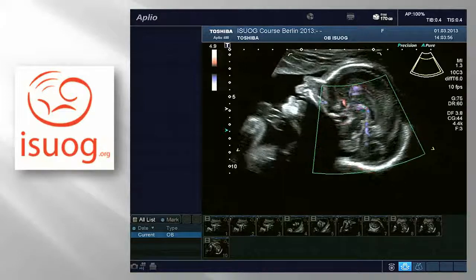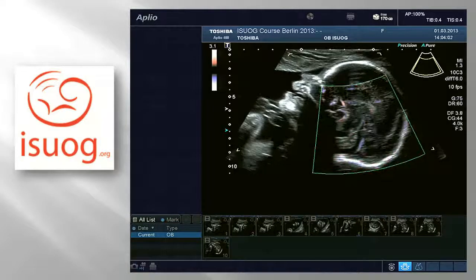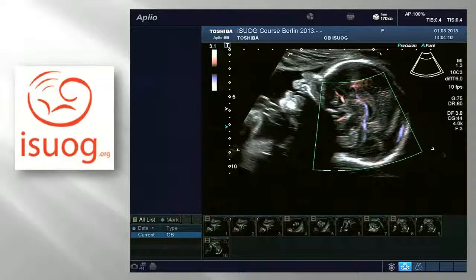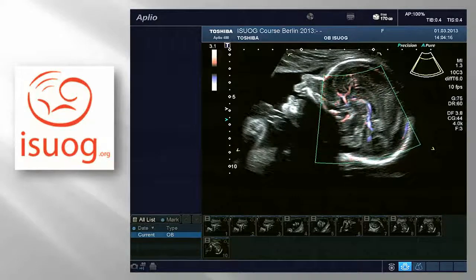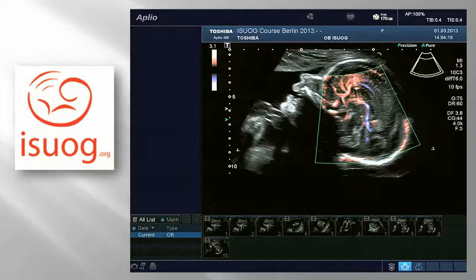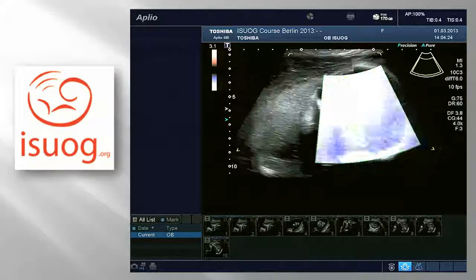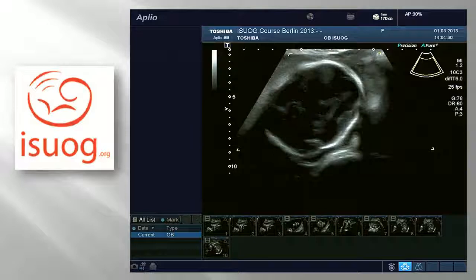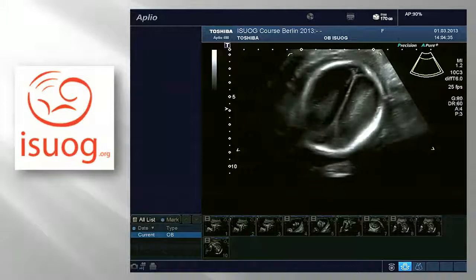And you can see vascular anatomy helps a lot to understand. You can see very well the vein of Galen, the straight sinus going down all the way. You can infer the position of the tentorium from the straight sinus. And you can see that the cerebellar vermis is closing completely the fourth ventricle, lying against, so the angle is really 0. Can you switch off there? And if you angle a bit the transducer, then you can see both hemispheres.